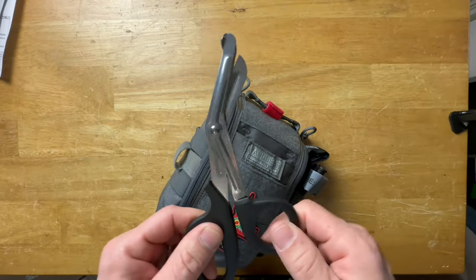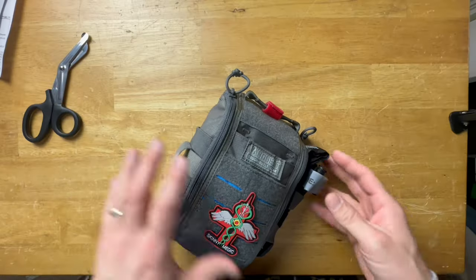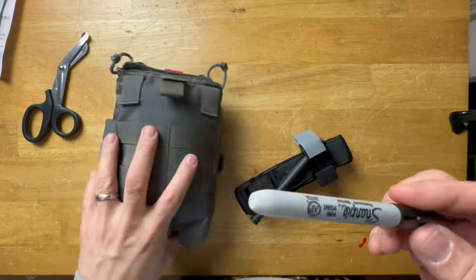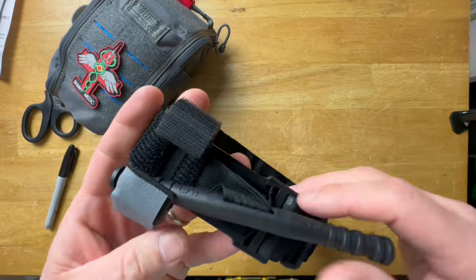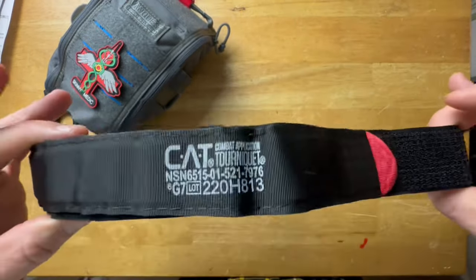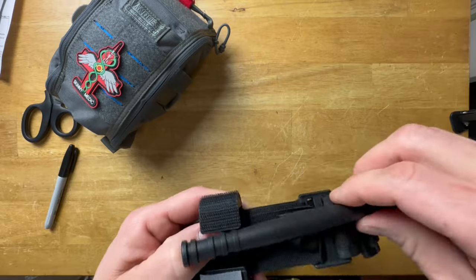On one side there's stretchy elastic material, and it comes with a set of trauma shears — great for cutting clothing or a seat belt. On the other side you have a Sharpie if you need to take notes or write on something. And there's a CAT tourniquet. In my opinion the CAT is the best all-around tourniquet. You need to stage this correctly — please don't leave it in the packaging. Seconds could matter, so it's not worth taking the chance.